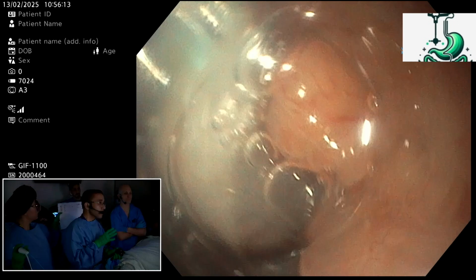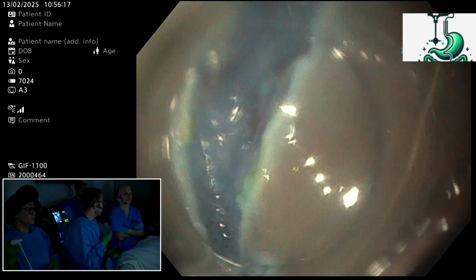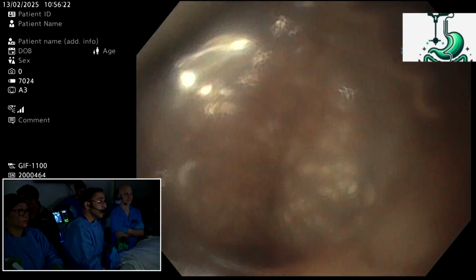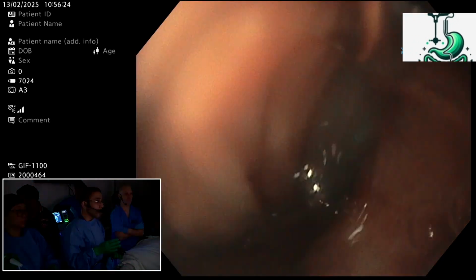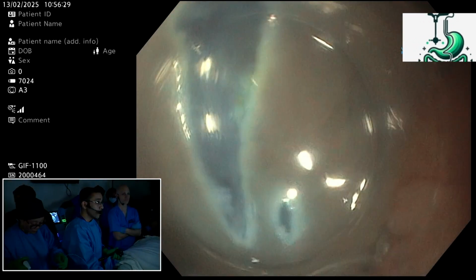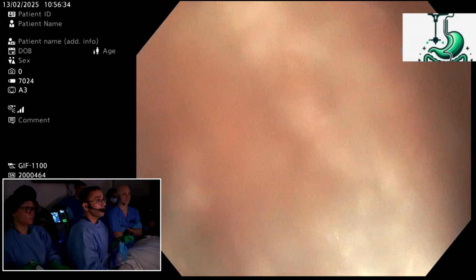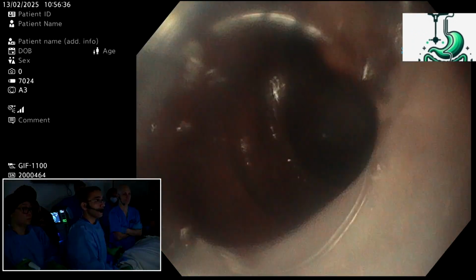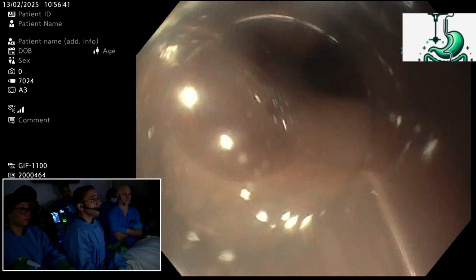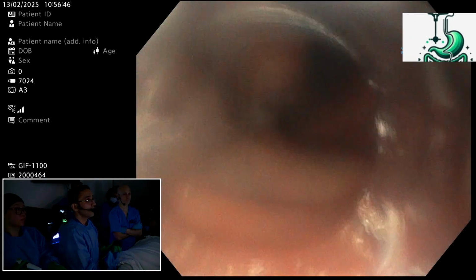We were in a discussion while we were offline with Dr. Murino. What is the strategy? Yes. And how should we approach this lesion? This lesion is not so large, but actually sigmoid is one of the challenging locations, and you should have a good strategy for it. So my strategy was to do incision from retroflexion and forward view, and try to connect them and open the side. And we actually start to do the incision from forward view, and we'll continue then to work from retroflexion.